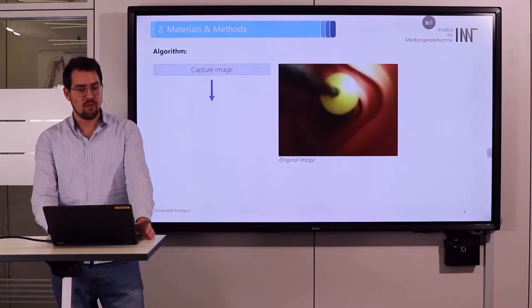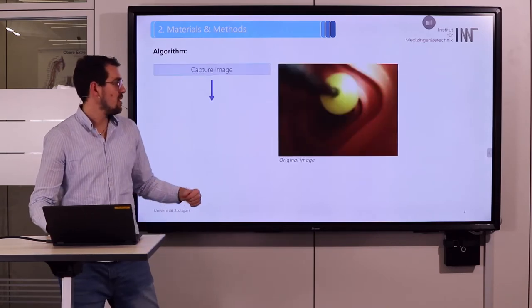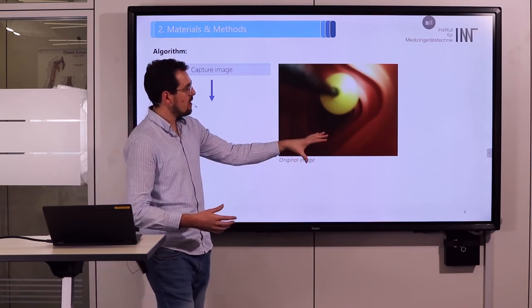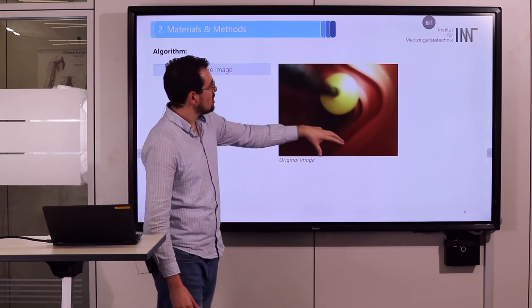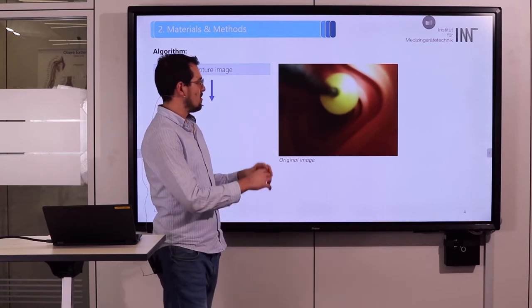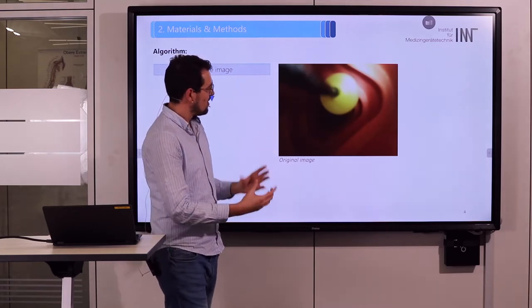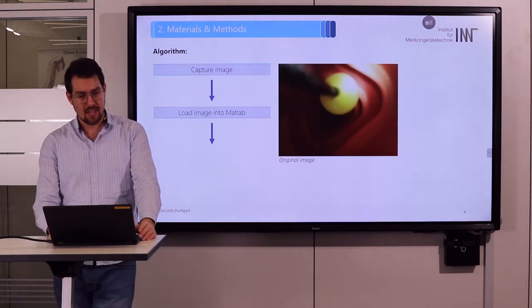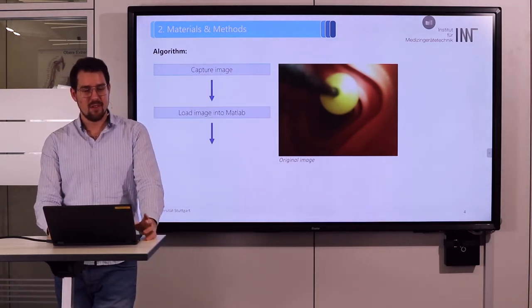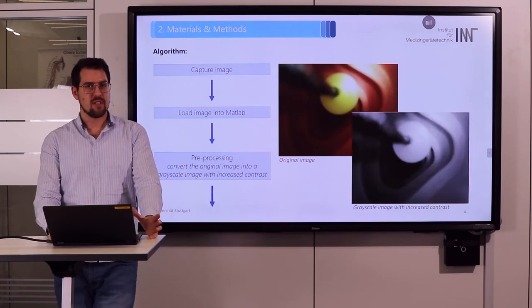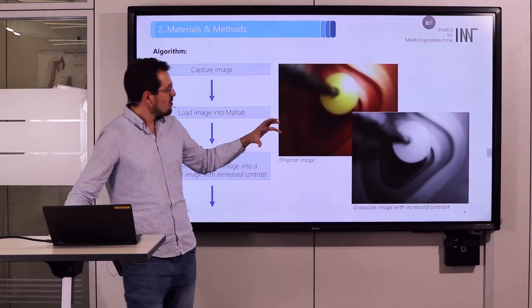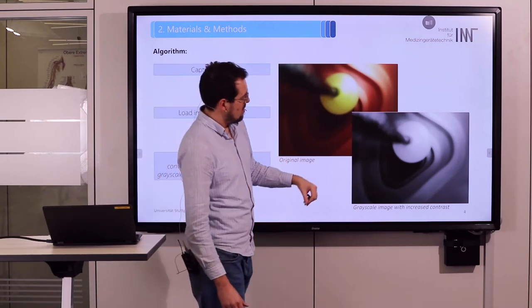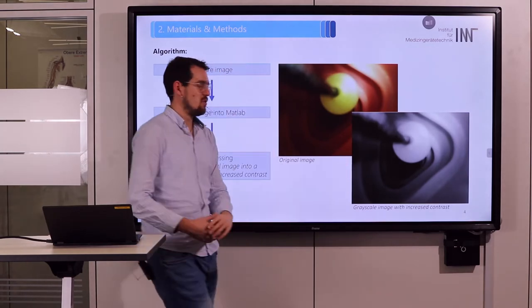For the algorithm, first we capture an image. In our colon model, you see the intestine and in front of us the big yellow sphere which is our balloon. We load this image into MATLAB and perform pre-processing where the original image is converted to grayscale with increased contrast.